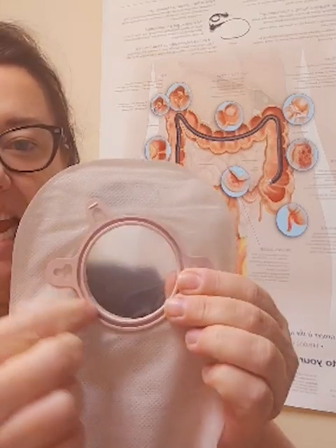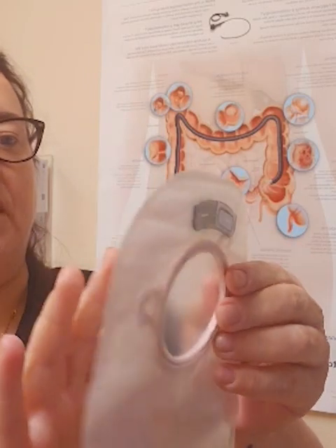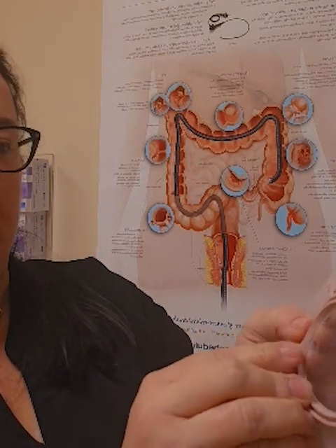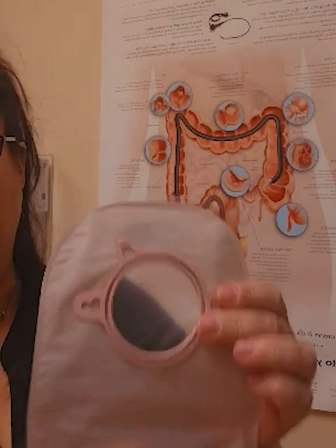And there also are 2-piece appliances where there's a backing that sticks to the skin, and then the bag itself will connect through this ring, and it connects to that sticky part that's the backing that stays on the skin. This allows for you to kind of burp the bag, which means that you can detach this ring from the backing and let the air out of the bag.